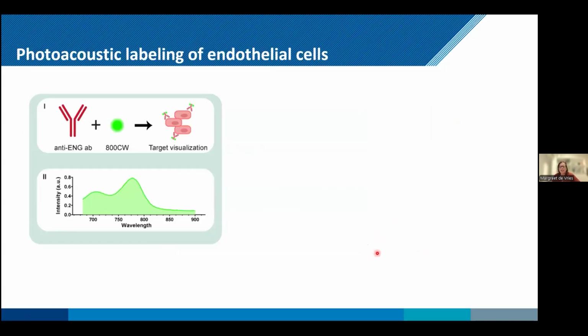To study these neovessels more specifically using photoacoustic imaging, we labeled anti-endoglin antibodies that specifically can image activated endothelial cells with 800CW.